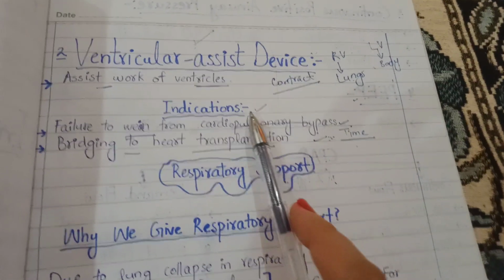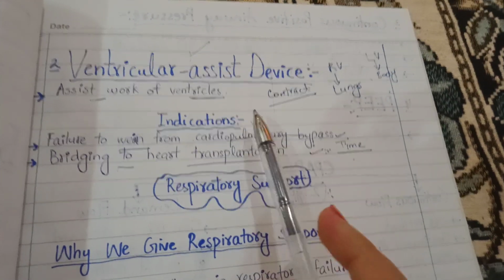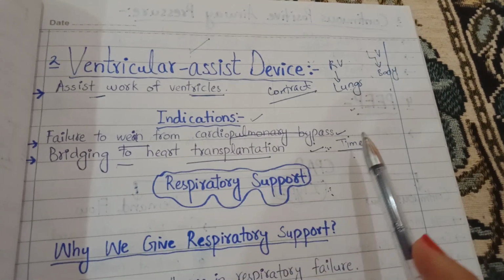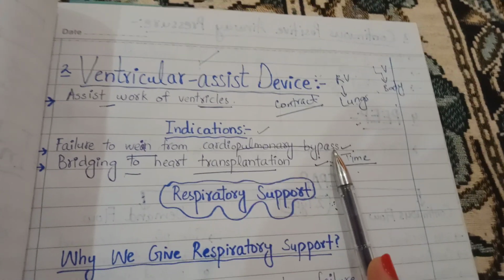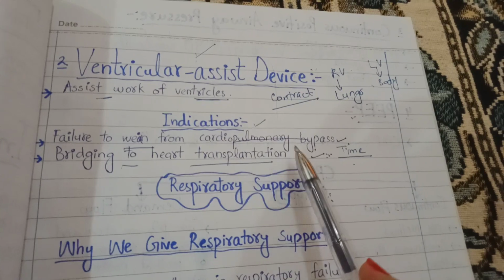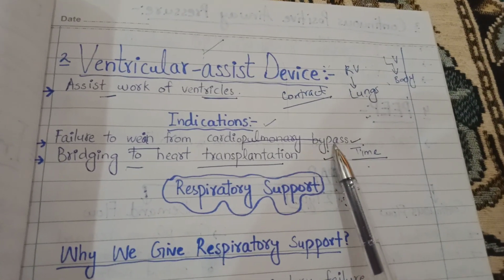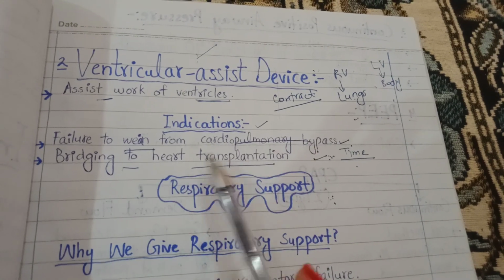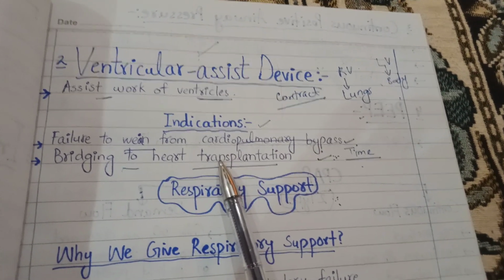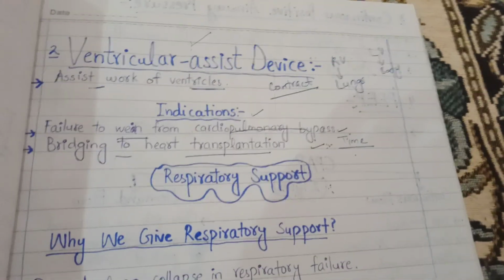Now we will discuss indications of ventricular assist device. The indication of ventricular assist device is failure to wean from cardiopulmonary bypass, means if the patient has used intra-aortic balloon pump during cardiopulmonary bypass and there is a failure to wean from intra-aortic balloon pump, then we will use ventricular assist device. Bridging to heart transplantation.